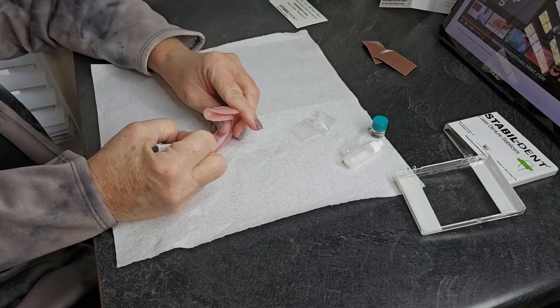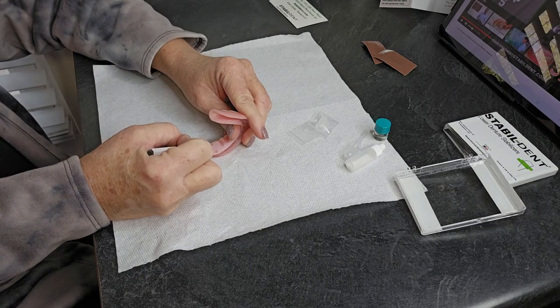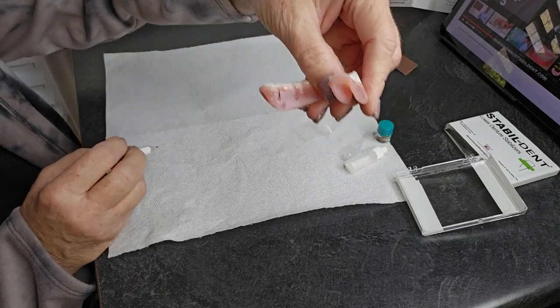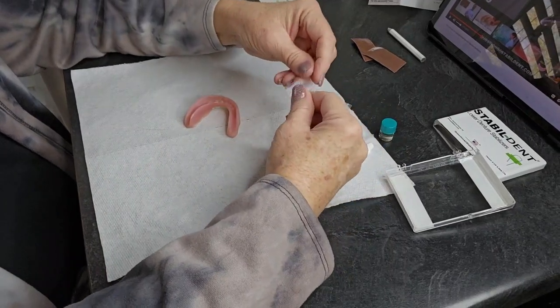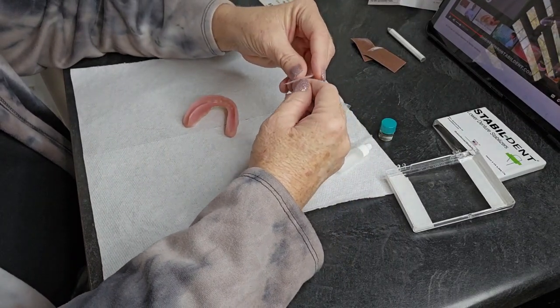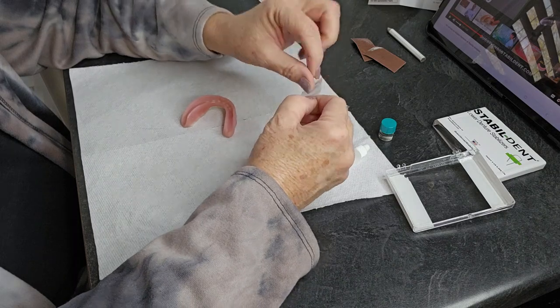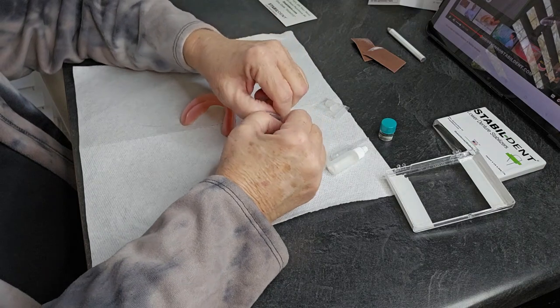There's our line — we have that. Now we're going to examine these stabilizers. We need the R for the right and the L for the left. So we're going to do this together — arts and crafts with dentures, that's what we like to do around here. I can see the R and the L.